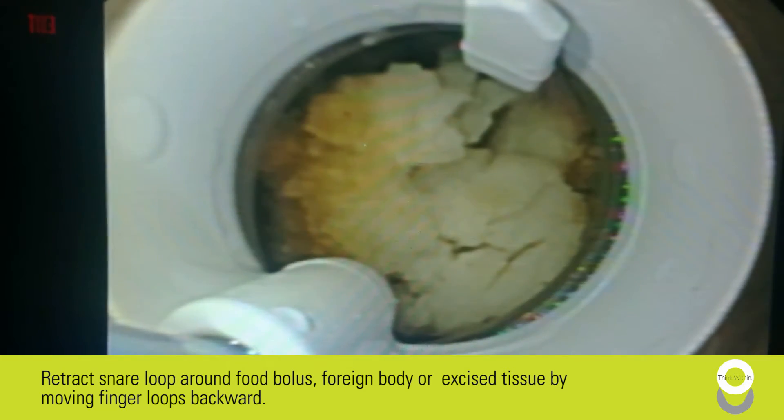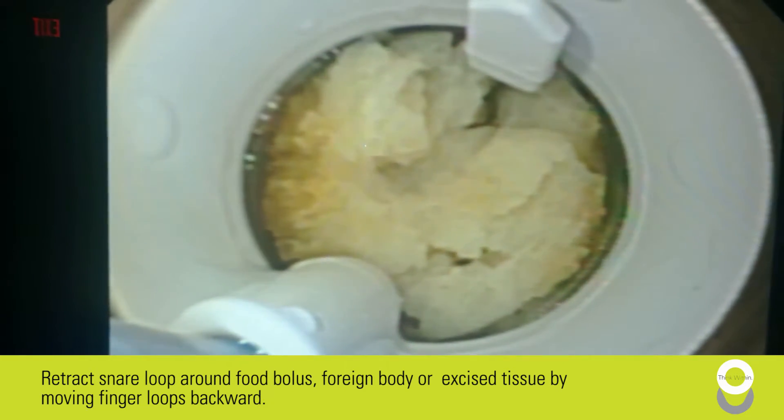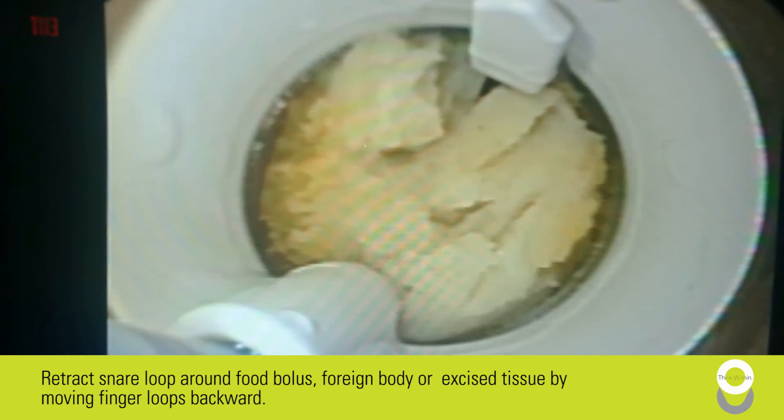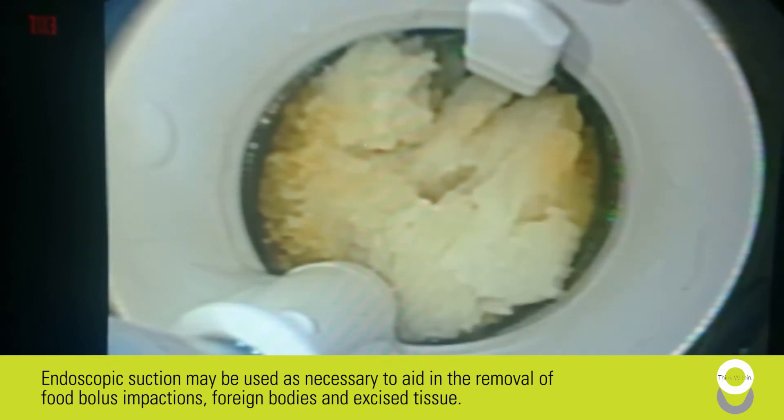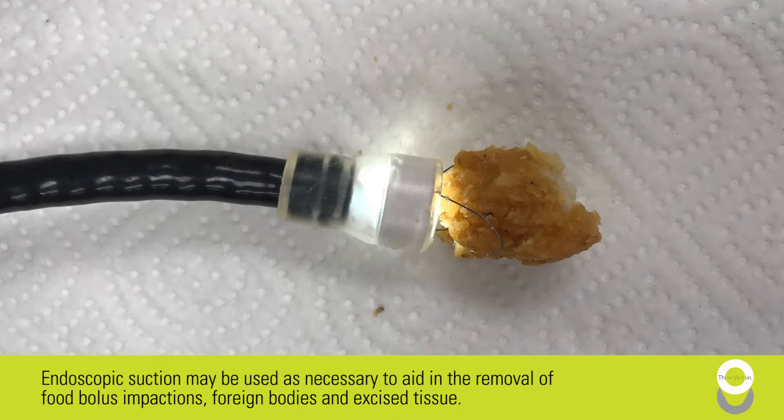Retract the snare loop with food bolus, foreign body, or excise tissue by moving finger loops backward. Endoscopic suction may be used as necessary to aid in the removal of food bolus impactions, foreign bodies, and excise tissue.